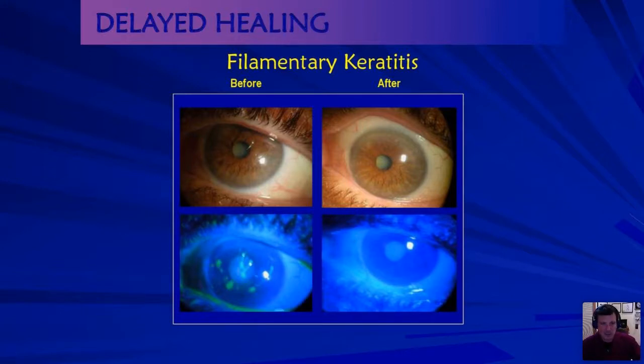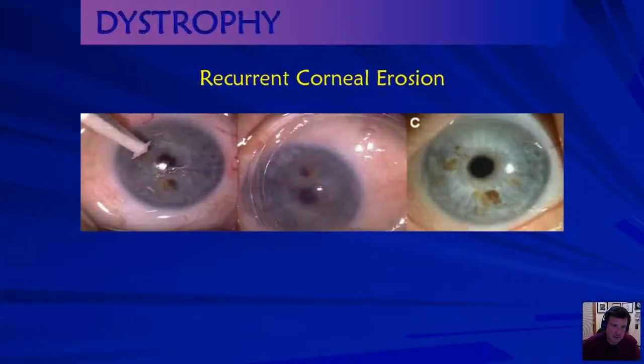They come in, we do the one eye because it's blurry. Then we bring them back about a week later, and take the one off and put the other one on, and they're good for that next 6 to 12 months.